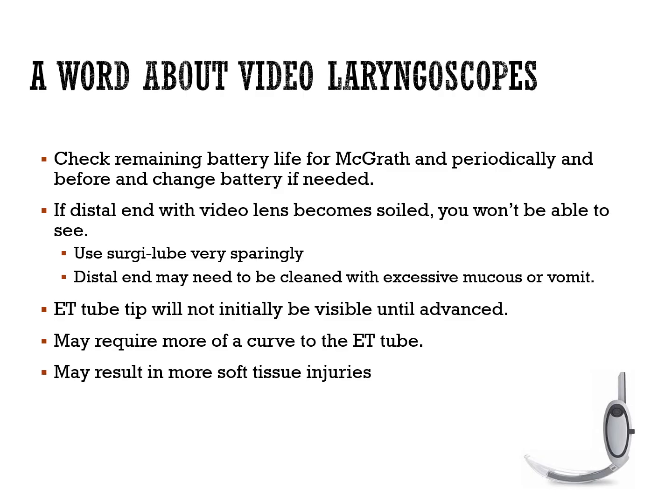So I'll say a word about video laryngoscopes. I'm going to say more than a word. Obviously, there's more than a word on this slide. But video laryngoscopes are becoming the standard of care, and there's a variety of different types out there.